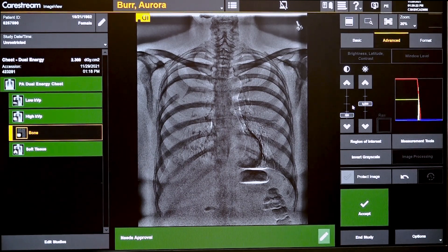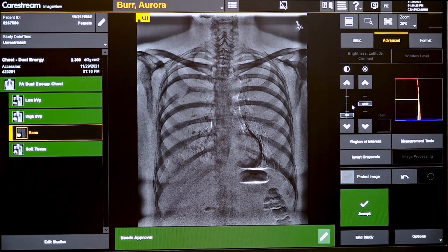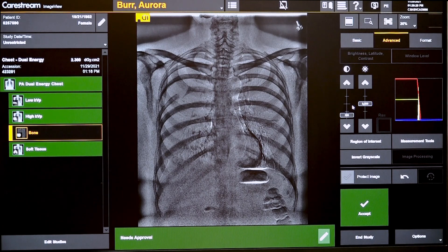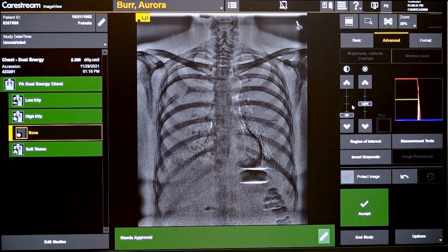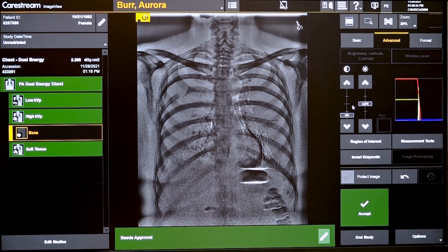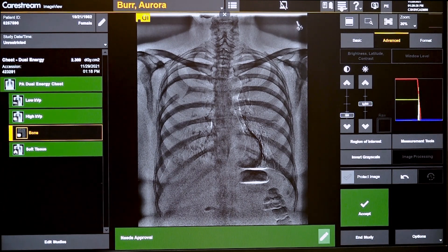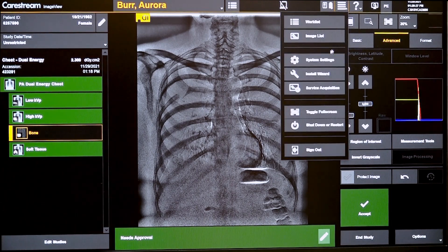From an acquisition perspective, it's basically just the technologist or radiographer performing a single x-ray like they would today, except the system automatically acquires the two shots.